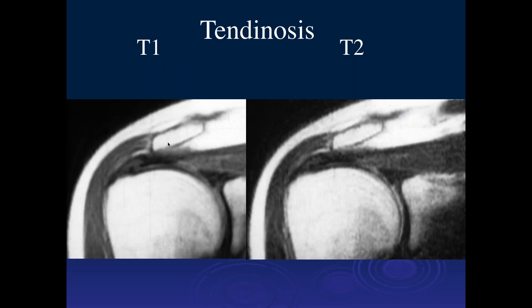When you get tendinosis, you start getting increased signal intensity on the short TE images. In more severe tendinosis, we can also see abnormal signal intensity on the T2-weighted image. A low level of tendinosis would be black on T2; moderate tendinosis shows increased signal intensity on both sequences.